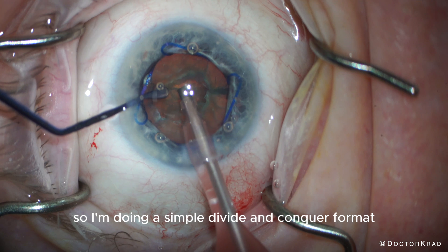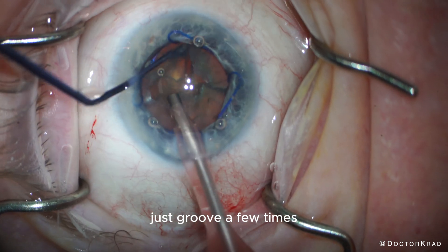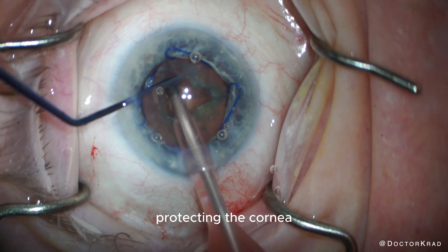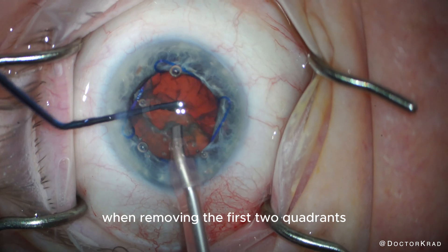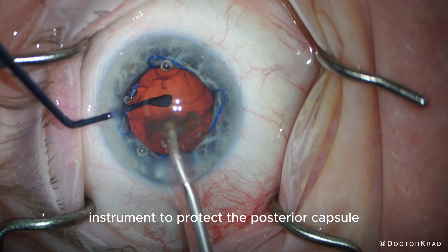So I'm doing a simple divide and conquer format — just groove a few times, separate, and then take out the quadrants protecting the cornea. Always protect the cornea with your second instrument when removing the first two quadrants. When you're removing the last piece, use your second instrument to protect the posterior capsule.